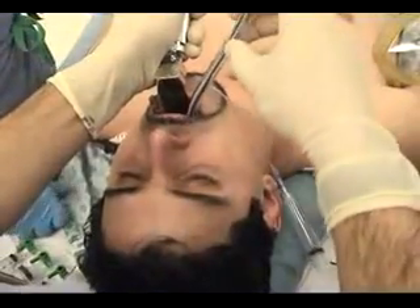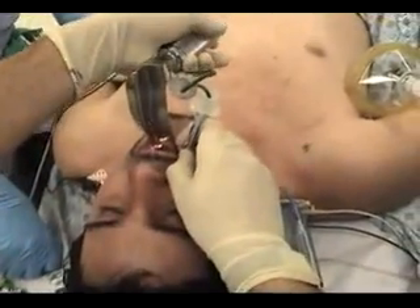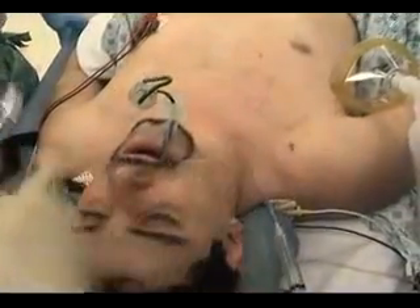The most common way of securing the airway with an endotracheal tube is with conventional direct laryngoscopy using a curved blade. Here are some details to help you improve your technique and minimize complications.